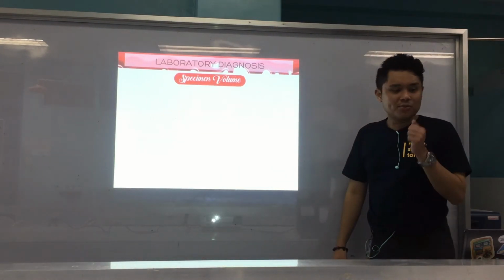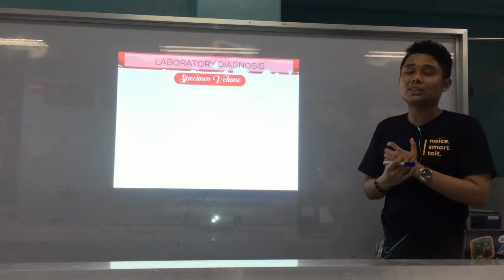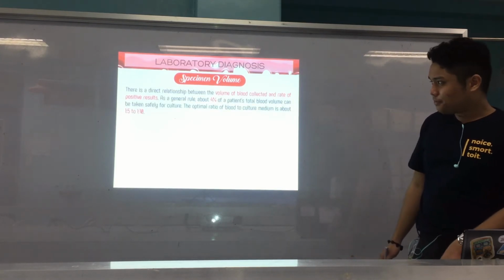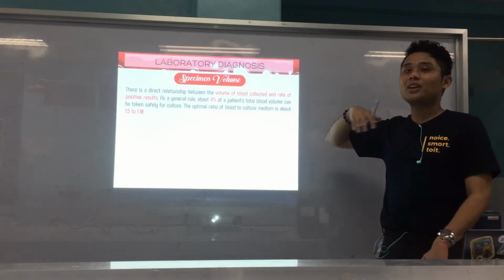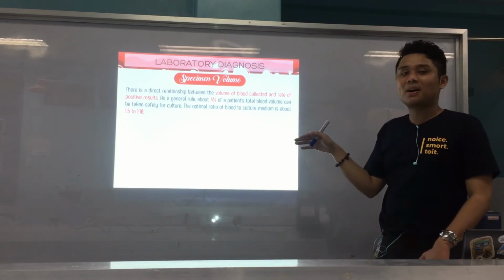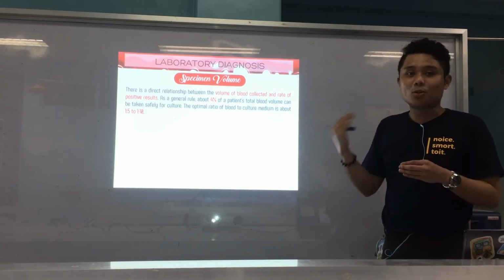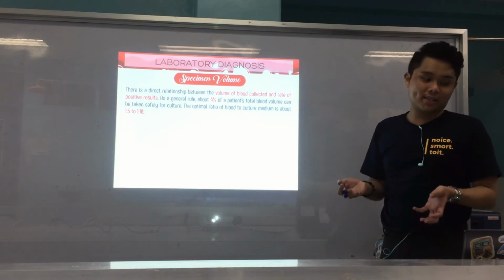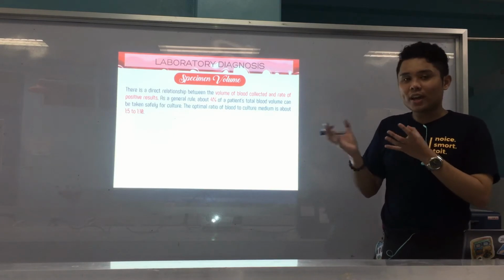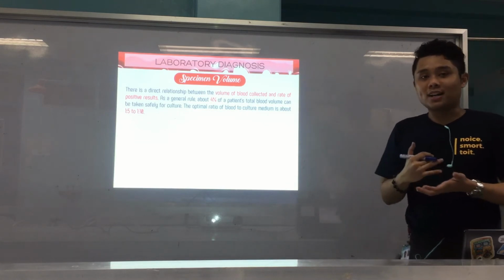Ayan, so that's for specimen collection. Again, ang point lang yun is follow asepsis, antisepsis. Okay? Para dili maka-introduce o external contaminants. Because we don't want that. Okay? Alright. Ayan, now we go na to specimen volume. So, as mentioned here, it's important po now we know the volume kung pila to i-collect. And there's a direct relationship daw with the volume of blood collected and the rate of positive results. Meaning, if daghan-daghan imo volume na makuha, of course, mas taas mo ang chance na ma-detect nimo tong kagaw. Kay medyo taas man ang volume imo nakuha sa blood. Right? Samot na if gamay pa ang concentration sa kagaw sa imong blood, so mas okay yun na daghan ka ma-collect because again, mas higher or mas taas imong chance na ma-detect jud tong kagaw. Alright? Okay.